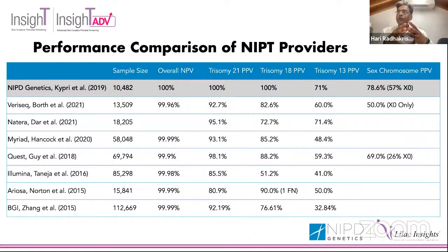This is a summary of different providers who have published a clinical performance study just like us, and we are very happy to report that the performance of our NIPT compared to the other technologies is much more superior.